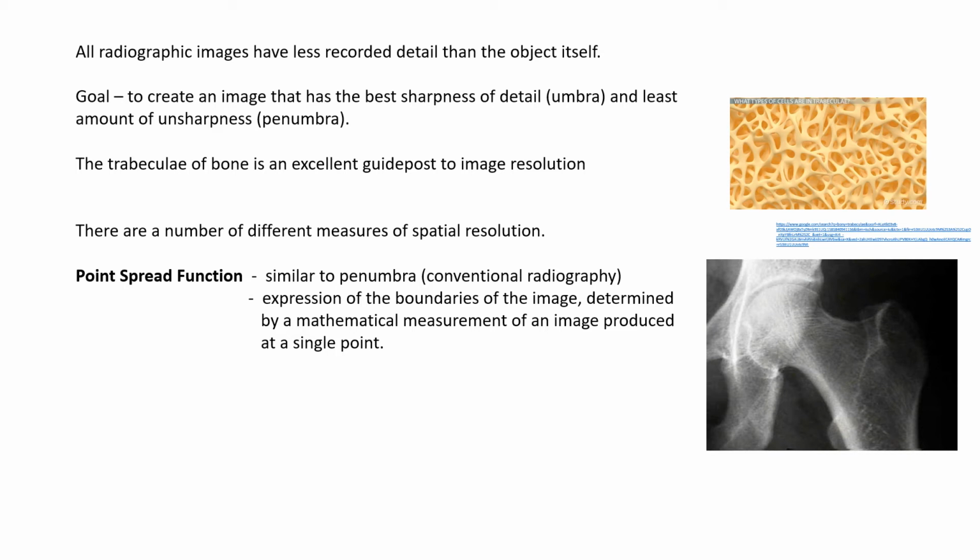Well, when we take a look at an image, we're looking at really individual little points, and these little points are put together very, very closely. If I have the point larger, and then I'm looking at the image, I'm not going to get as much detail. If I have fine little tiny points creating the image, I'm going to have better detail. So point spread: is that single point spread out, or is it more fine-tuned?